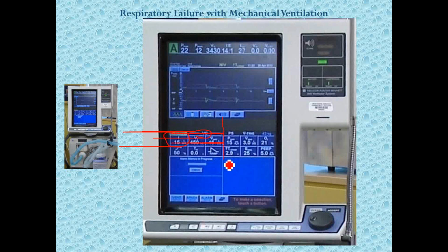So I always draw an imaginary line here, and I say, okay, on this side of the ventilator is the volume amount and the respiratory rate, and that is the respiratory rate that is delivered by the ventilator. And these two things, the volume amount and the respiratory rate, control CO2. So on this side of the screen, and I don't know why it has these weird lines, but you'll just have to kind of deal with it.